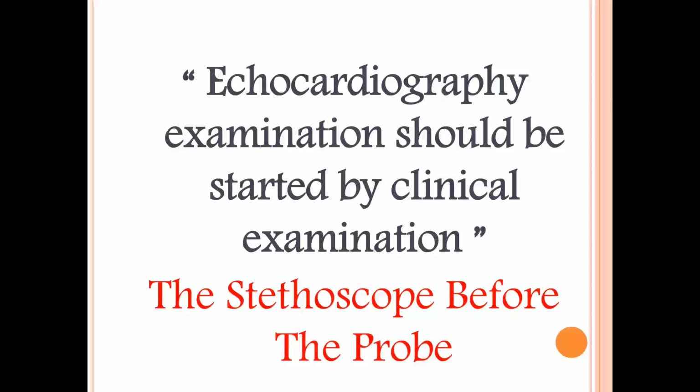There is a golden rule which we should all know, that echocardiographic examination should be started by our clinical examination. That's to say that the stethoscope should be before the probe. You have to auscultate the patient, you have to take some history from the patient, and then you start your echocardiographic examination.